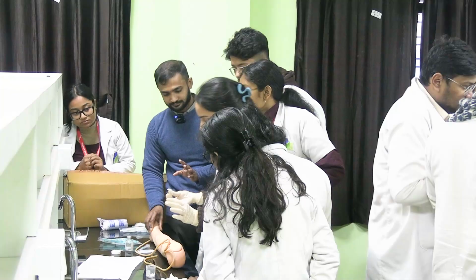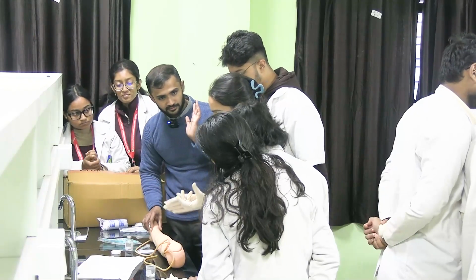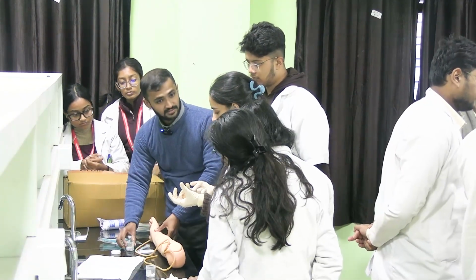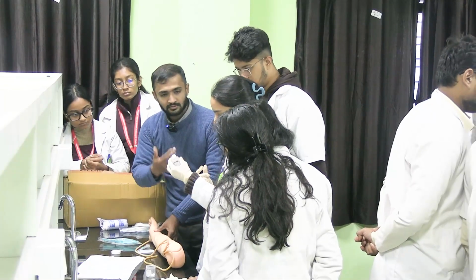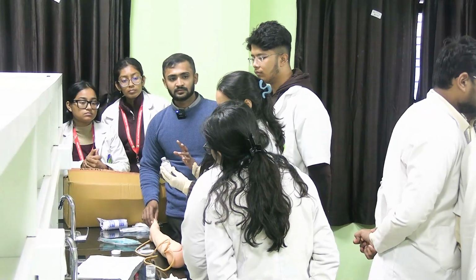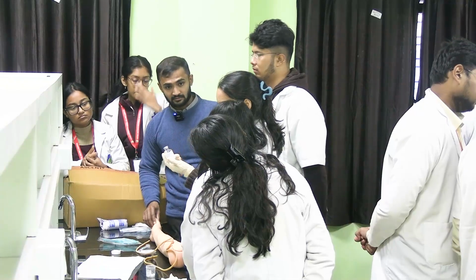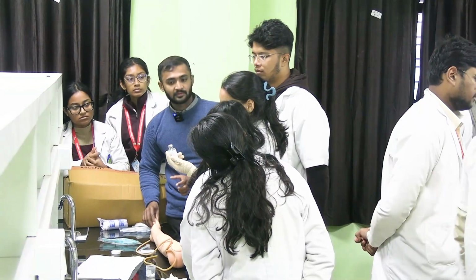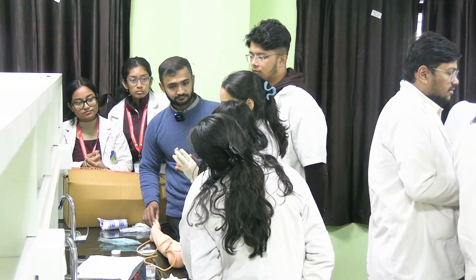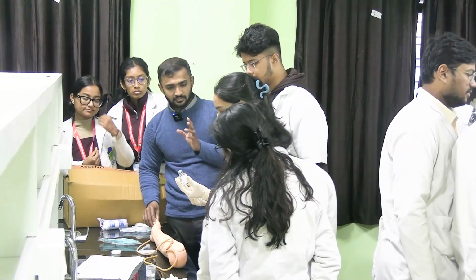What is the next step? Next step, sir, I'll take the vial. Then you have to wait for it to air dry. Remember this from your physiology. After that you have to check the medicine. What things will you be checking here? Whether it is sealed or not. Then the name of the drug, whether it is correct, then the dose, how much you'll be introducing, the manufacturing and expiry dates, then the color of the solution. Sometimes it might be within the expiry, but the color might have changed. So you have checked it, this is fine.